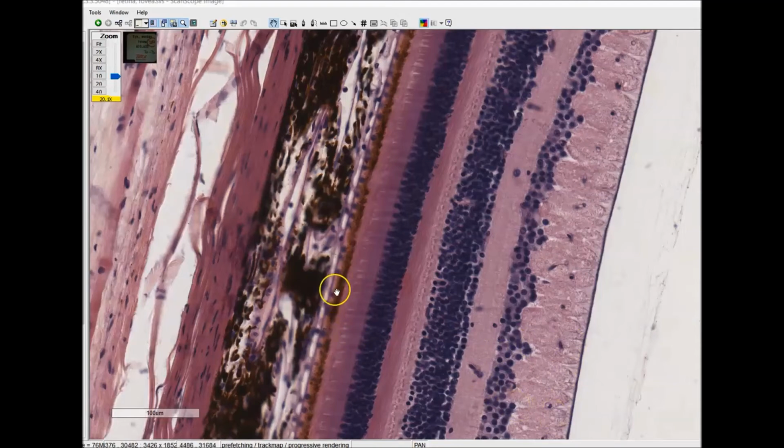So retinal pigment epithelium here has a lot of functions, as talked about in the self-study material. And you can see that it has pigment in it, along with the choroid, which is heavily pigmented. And all this pigment here helps to absorb the reflections and minimize glare of light that makes it all the way through past the photoreceptors, so it doesn't bounce back and cause a lot of problems.